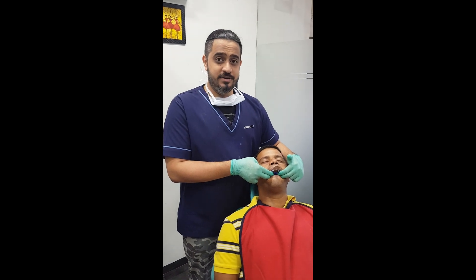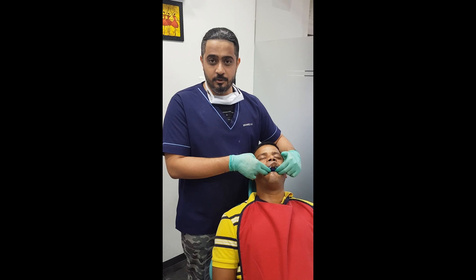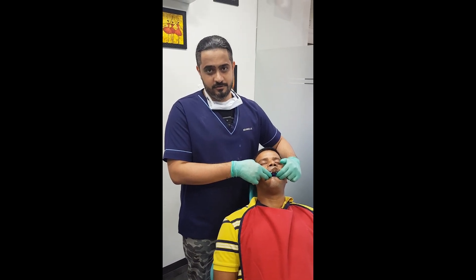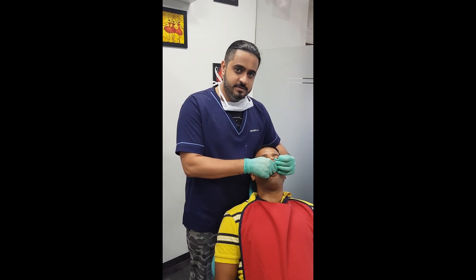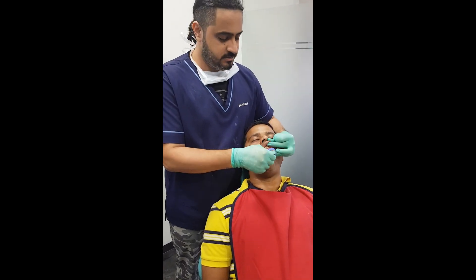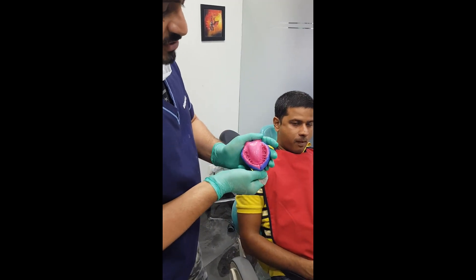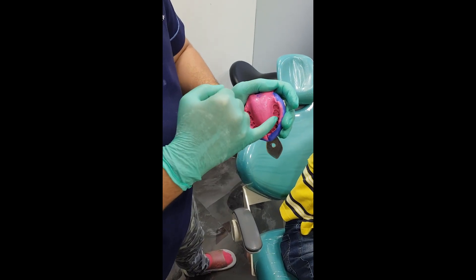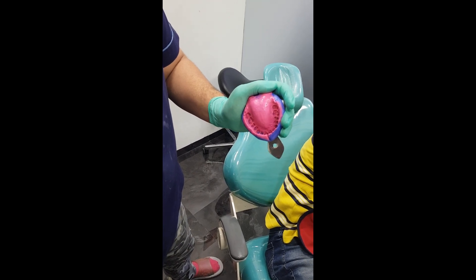I have been holding this tray in the patient's mouth for almost four minutes. In the next few seconds, the alarm goes off — that is when I go ahead and retrieve the impression from the patient's mouth. Always remove it with a snap so that you don't end up distorting the material at all. Let's quickly come in and have a look at the impression. You can see how beautifully every margin of every tooth has been recorded brilliantly in the light body.